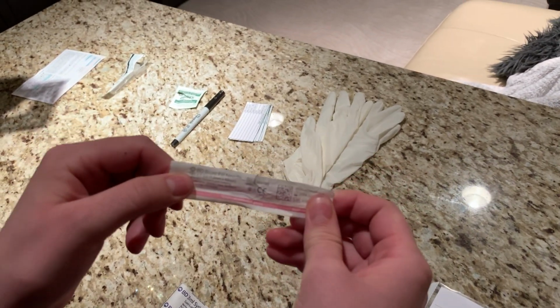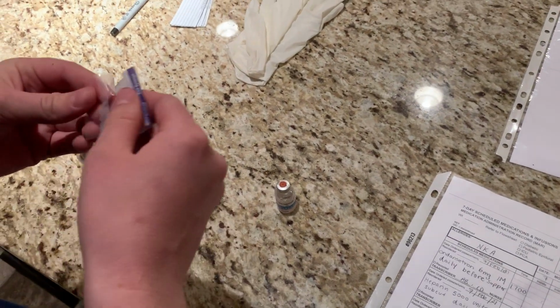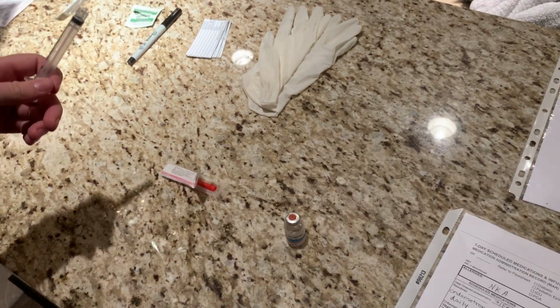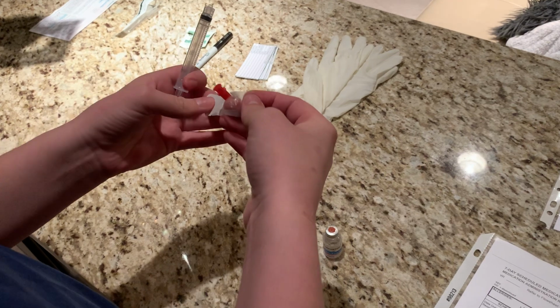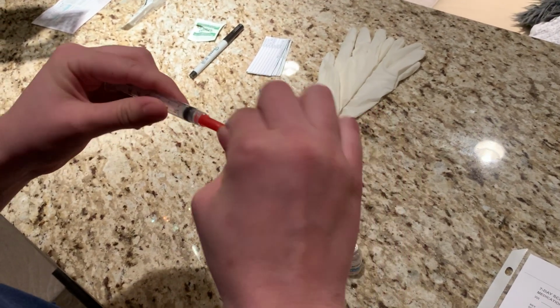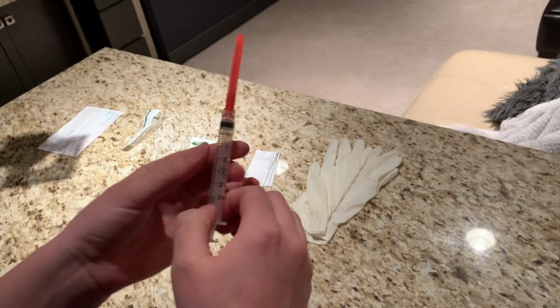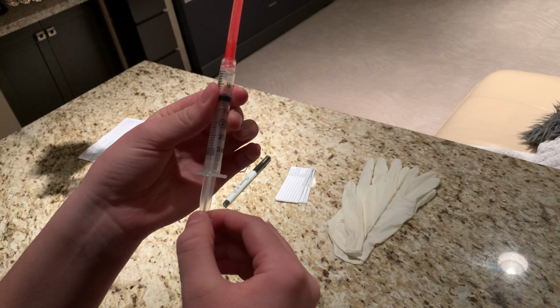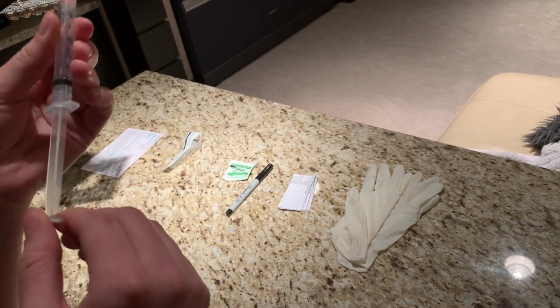I've chosen a blunt fill needle. So I'll attach the needle, and then since I'm going to be drawing up 3 milliliters of medication, I have to first inject 3 milliliters of air into the vial.